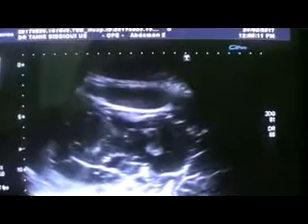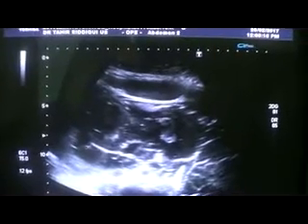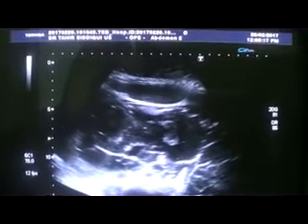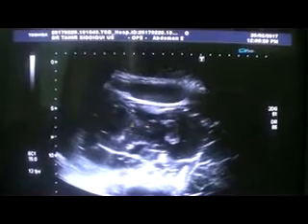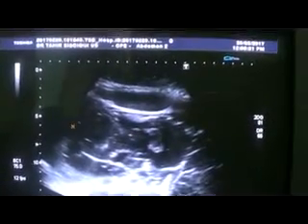Now I am in the epigastric region, and you see these are echoes. These are septa — thick, incomplete septa. This is a thick septum. There are minor tiny calcifications within it.